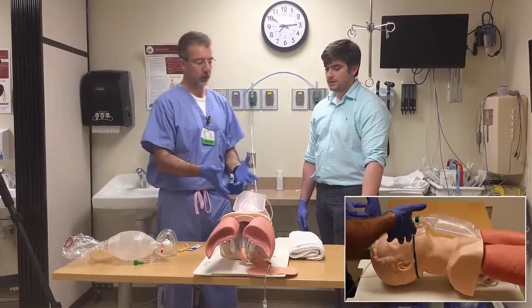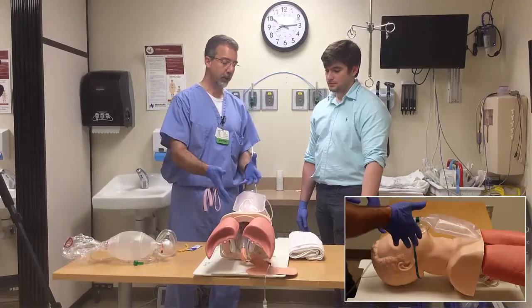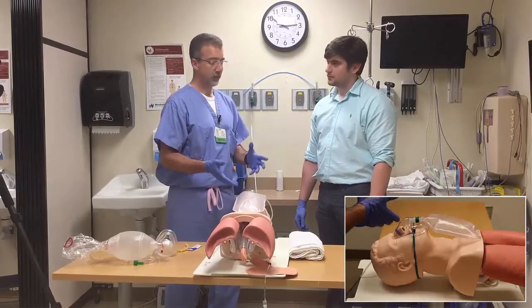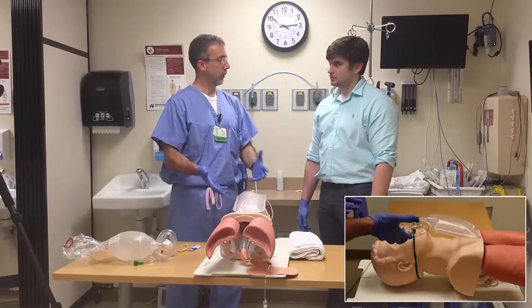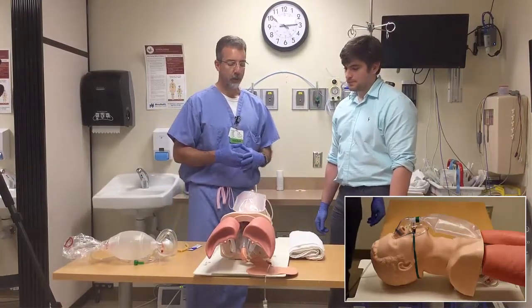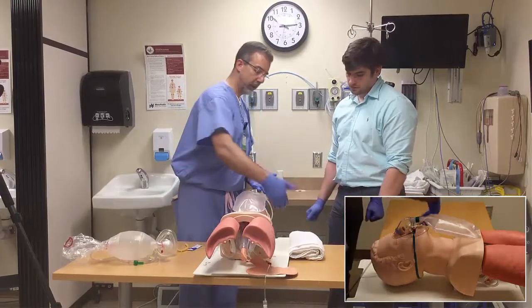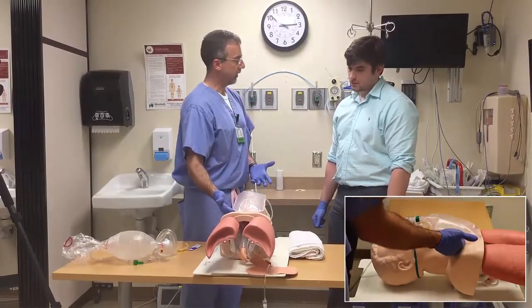We're going to use this airway head to demonstrate a few basic techniques. Our patient is already on a non-rebreather because they're in need of supplemental oxygen. First, you want to position him so that his airway is optimized — the alignment of the airway is right. Support his head and bring it up to an in-line position so that the tip of his pinna is in line with his sternal notch.